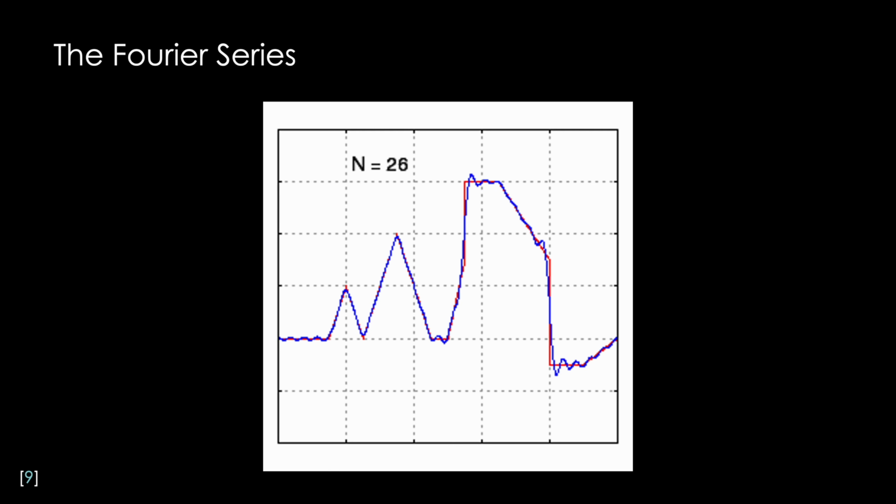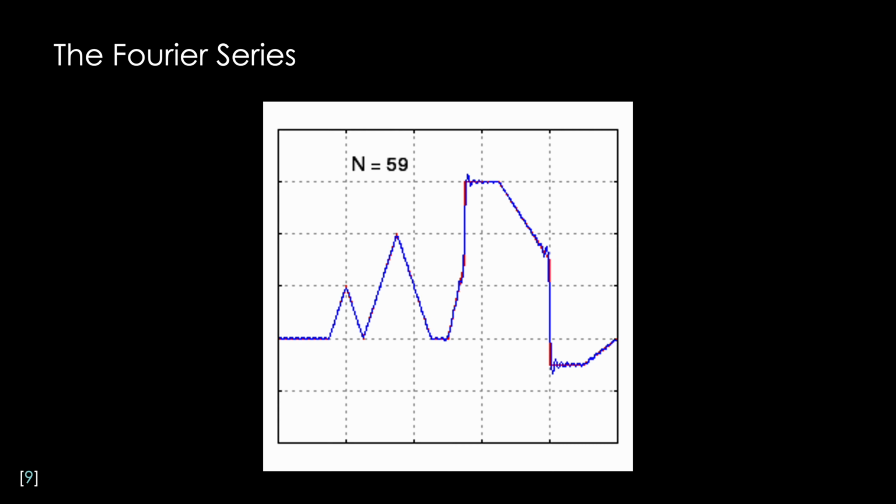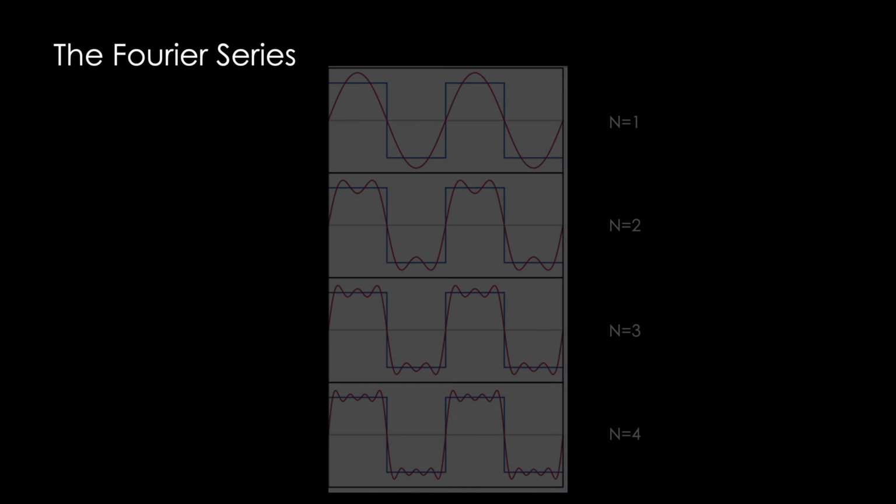But also notice there's a law of diminishing returns here. At some point, adding more changes the shape less and less, with these areas of extremely sharp transition the most difficult to resolve, what we call Gibbs phenomenon for all you MRI artifact lovers out there. And while it does get closer to the original function the longer we run this, it's going to come at the cost of increased computing time, so in practical applications, there will be a point we're going to have to say this is good enough. The cost of more iterations will provide little benefit.